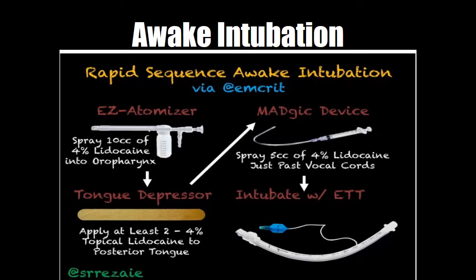But the problem is if you shove a tube through unanaesthetised cords, as soon as you hit the cords, they may go into laryngospasm, and you can't then advance the tube. But once you've got a view, you sort of establish that you actually don't have the problem that you are anticipating. I mean, I've certainly seen the anaesthetizing below the cords transcutaneous. Yes. I mean, that's sort of.